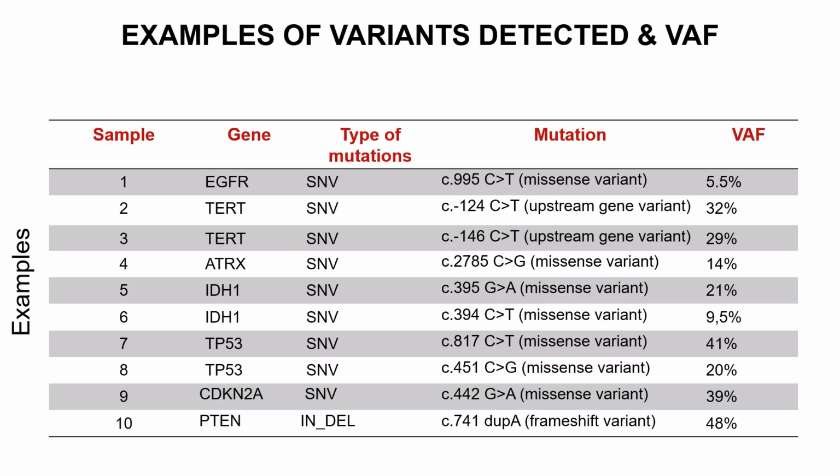Other mutations detected in our study included variants that are reported in this table. This table could indicate the extent of heterogeneity within the sample analyzed. So glioma is a very heterogeneous, and in particular glioblastoma is a very heterogeneous brain tumor subtype.